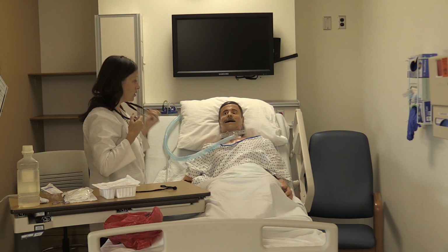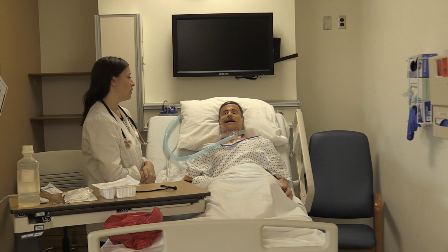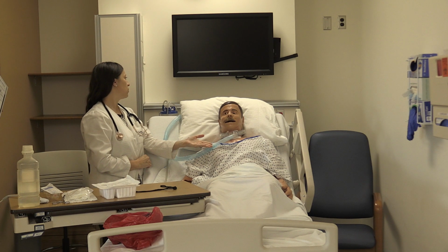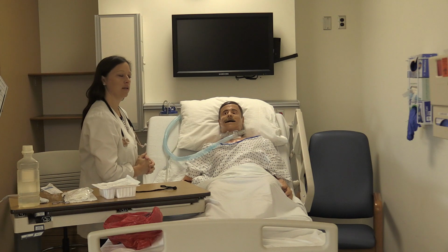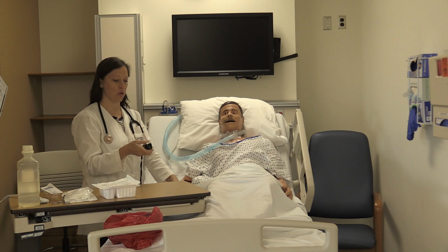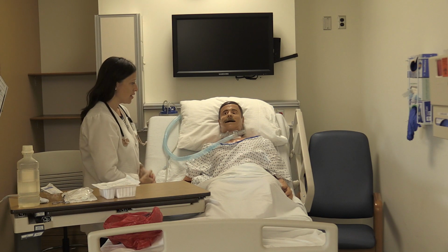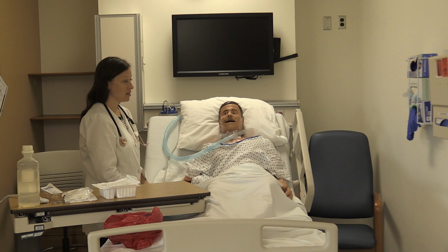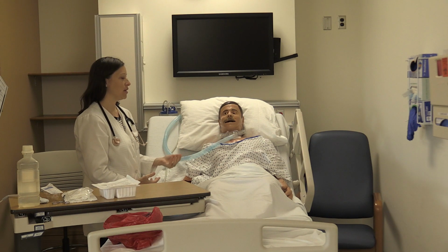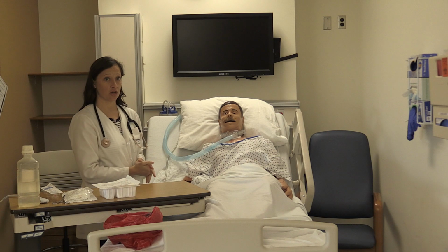I'm also going to note his respiratory situation. I notice that he's breathing a little labored, and I see that he's on oxygen. It's at pretty high flow oxygen, about 10 liters. But I'm wondering what his oxygen saturation is. So I'm going to go ahead and put a pulse oximeter on his finger, and it says it's 88%. So with this amount of oxygen that he's getting, the labored breathing and the crackles, it's definitely indicative that he needs to be having some suction.